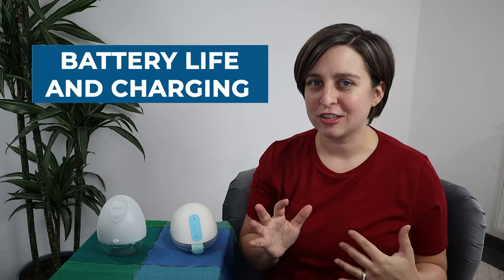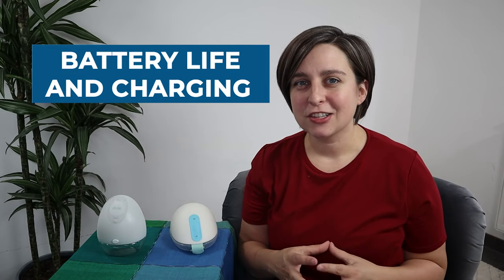Next is battery life and charging. Both pumps take about two hours to go from empty to full charge. The Willow gives about five pumping sessions on one full charge, and a quick 20-minute charge will get you through one session. The Elvie offers about two and a half hours of battery life on a full charge, and I've charged it for just 15 minutes and made it through an entire pump session. This one is a draw.